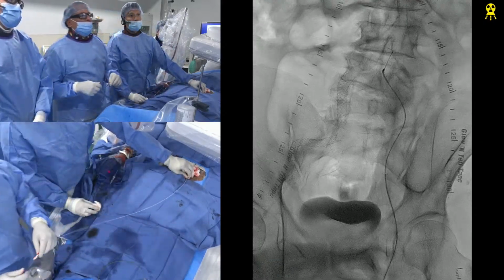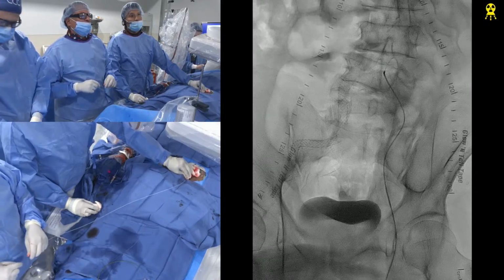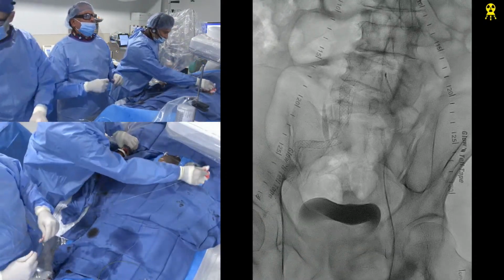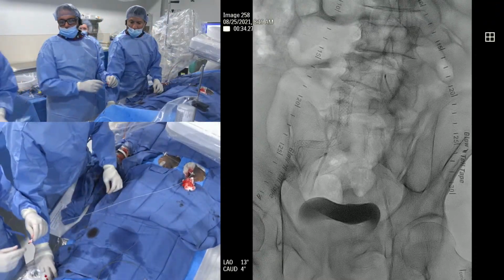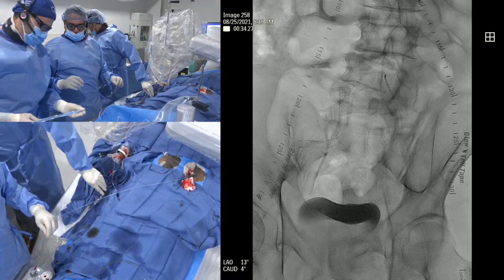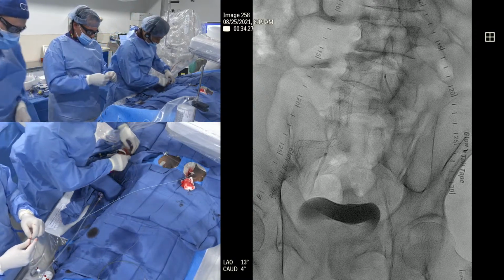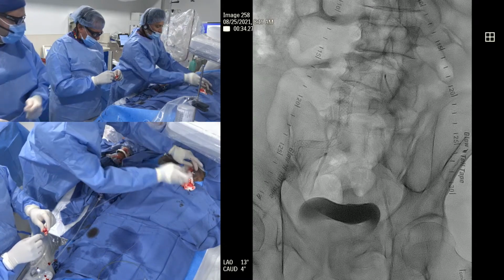All right, give us an 014 wire, guys. Spartacore. No, I wouldn't do Spartacore. Give me like a Runthrough or something. Strange. Wow, this is really tough. Oh. Don't move. All right, give us a Runthrough. What's that, dear? Give me a shaper. No. What happened? No, he's just moving a lot.